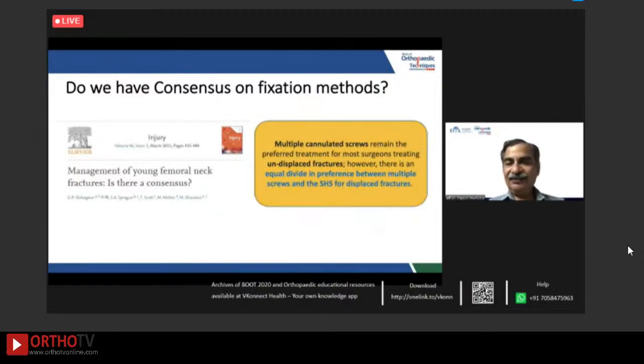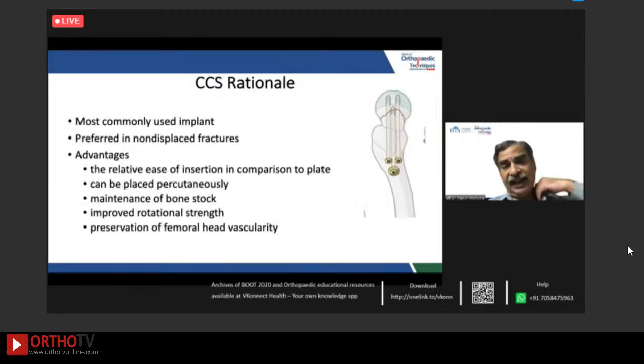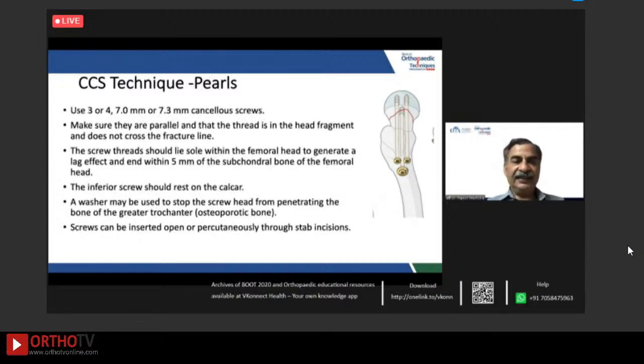There's no consensus for displaced fractures, with an equal divide between the multiple screws and the sliding hip screw system. What's the rationale for cancellous cannulated screws? They are most commonly used, easy to insert percutaneously, low blood loss, maintain the bone stock, improve the rotational strength, and maintain the head vascularity.